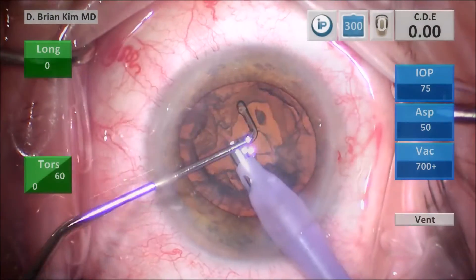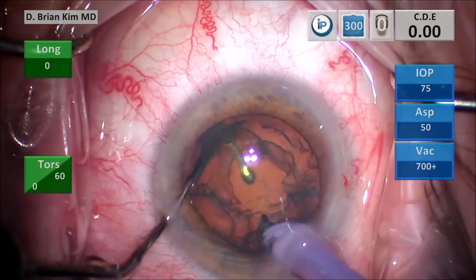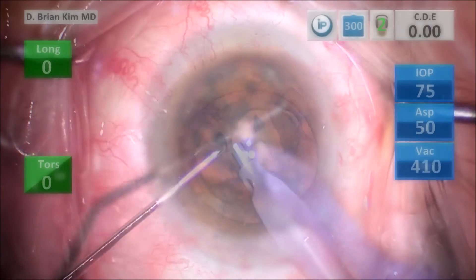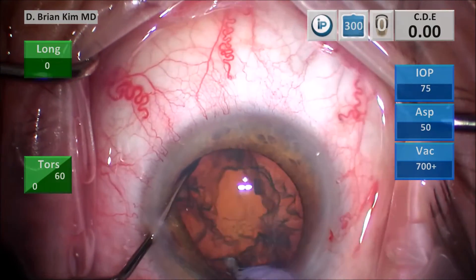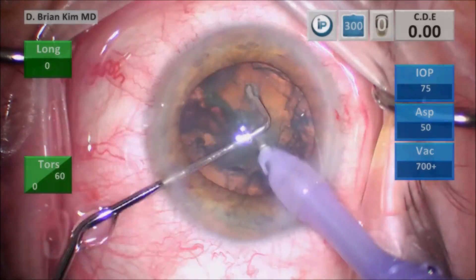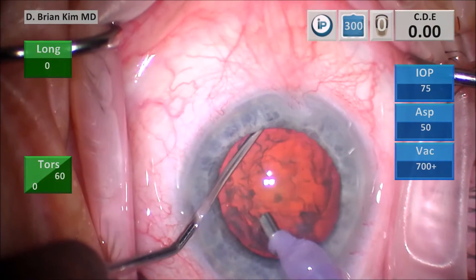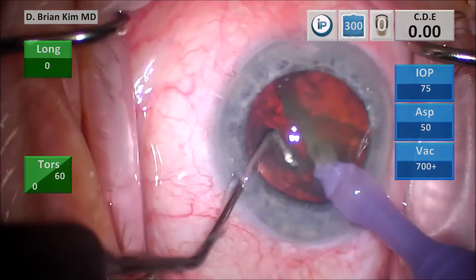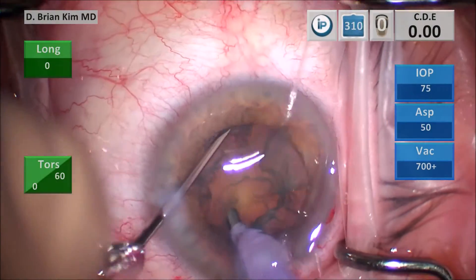I'm going to show this again with multiple examples. I'm going around the equator lifting up the lens — even cheese-wiring into the lens material in that case because it was a very soft lens, which you can do. I'm rotating and tilting that tip up a little bit, then driving the faco into the lens material and it fractures the lens. Again, lifting up with the chopper and then pushing down with the facotip and it fractures the lens.